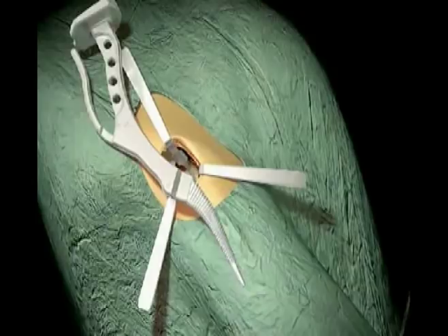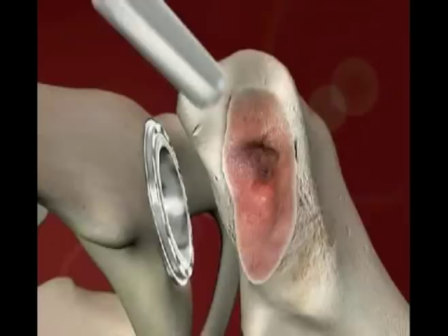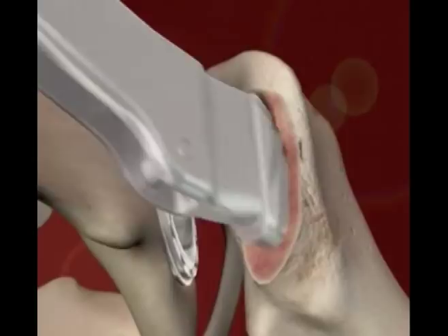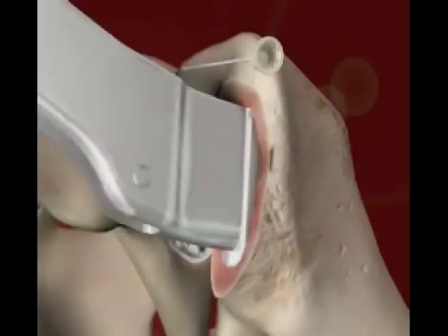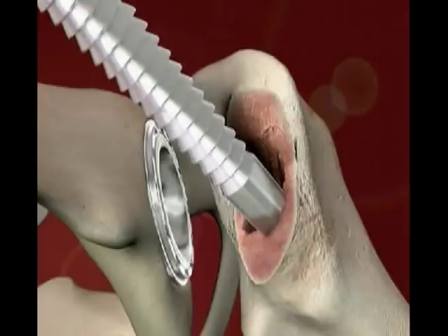Beginning with the smallest broach attached to the broach handle, the medullary cavity is progressively enlarged until the level of the neck resection is reached. The depth of the implant, established during femoral planning, is measured in relation to the greater trochanter using a needle to find the exact height of the greater trochanter. Broaching should continue until complete stability is achieved. The size of each broach matches the corresponding implant without HA coating.